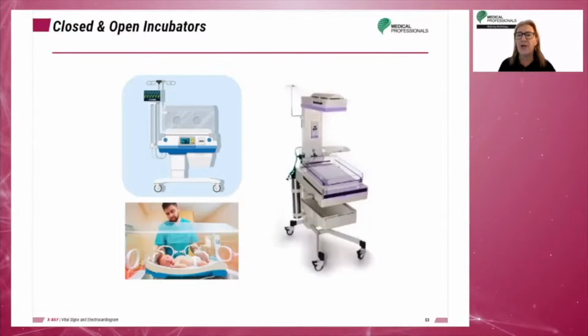Closed incubators are transparent enclosures that provide a warm environment for small infants with temperature instability. Supplemental oxygen can be added to incubators, but may result in a high oxygen concentration. The primary purpose of an incubator is to provide a temperature-controlled environment. The closed incubator can be used to deliver oxygen. The open incubator does not deliver oxygen.